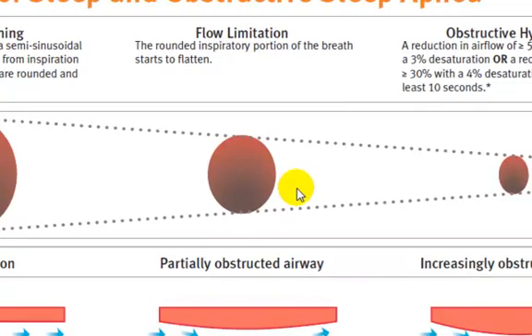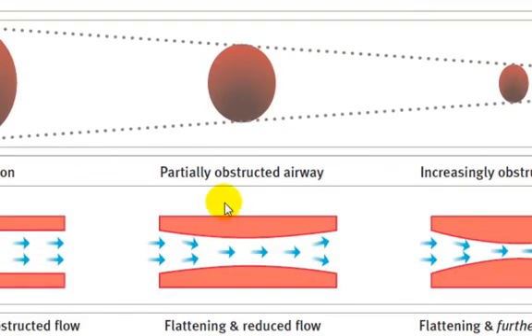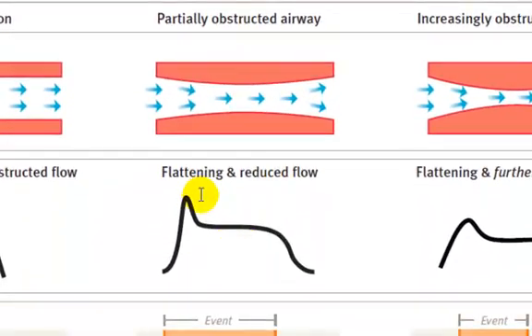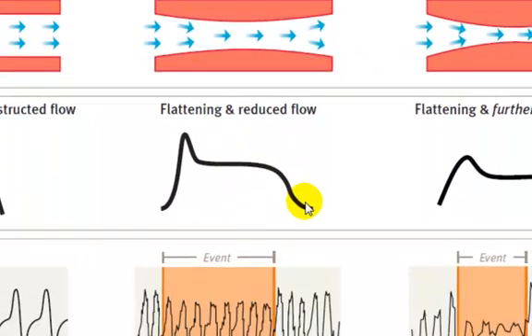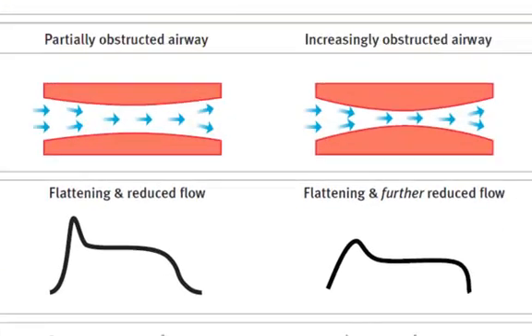A slight narrowing of the upper airway is indicated by flow limitation. Here you see a partially obstructed airway and a flattening on the inspiratory waveform. By definition, any time you see a plateau or flattening on the inspiratory waveform, that would be a flow limited event.